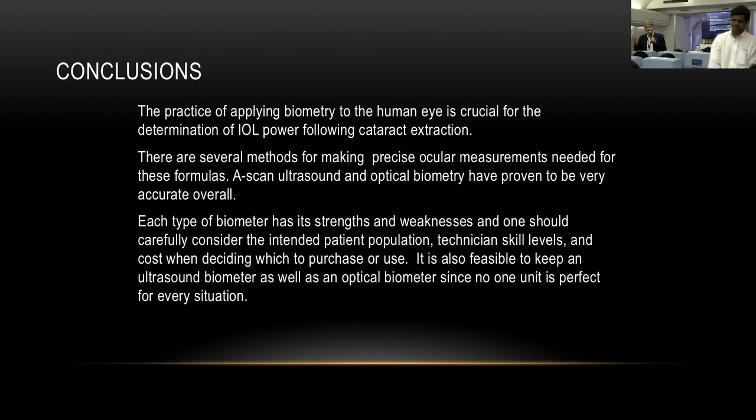A lot of the patients that we're doing surgery on this week and last week have very dense cataracts. And we worked a little bit this afternoon on a couple of our patients that are having surgery today, and our IOLMaster was unable to actually get a reading through the dense cataracts. So even if you do have an IOLMaster or a Lenstar, you may want to keep that A-scan handy for those people with very dense cataracts and the people who are not so easy to seat at these machines.